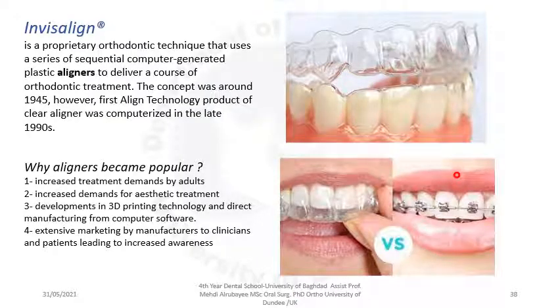The other subject is Invisalign, which is a proprietary orthodontic technique that uses a series of sequential computer-generated plastic aligners to deliver a course of orthodontic treatment. The concept was around in 1945; however, Align Technology's first clear aligner product was computerized in the late 1990s.